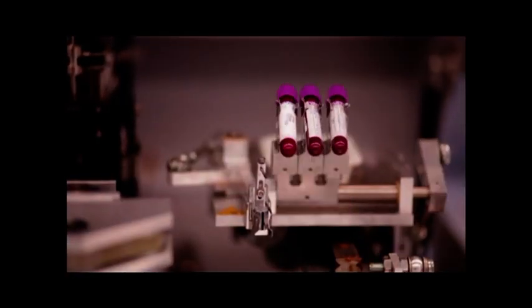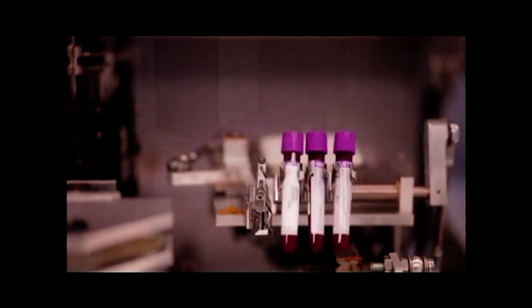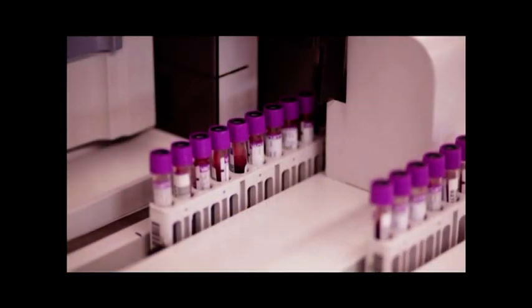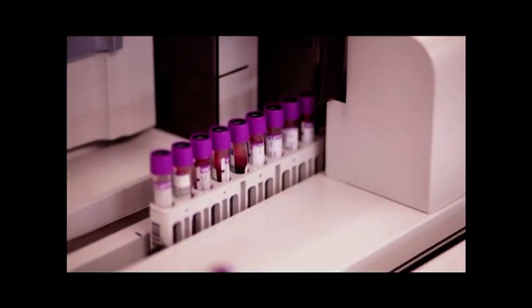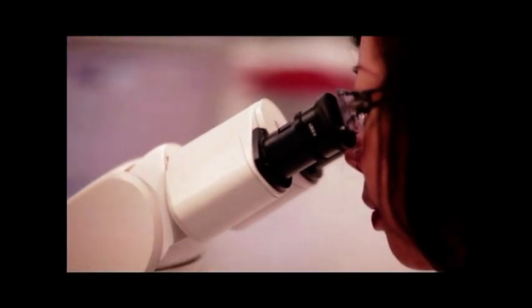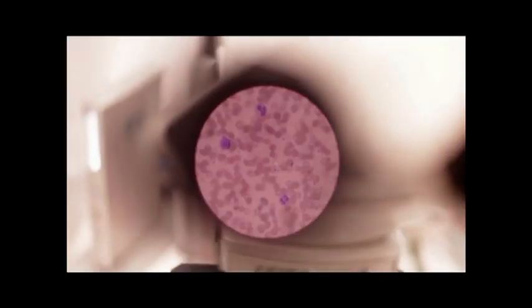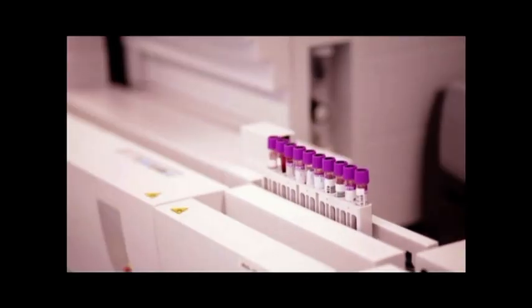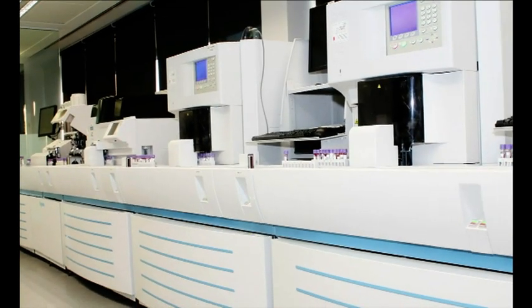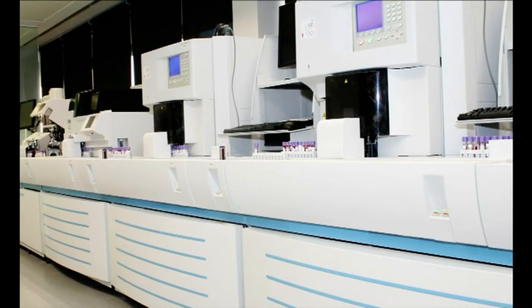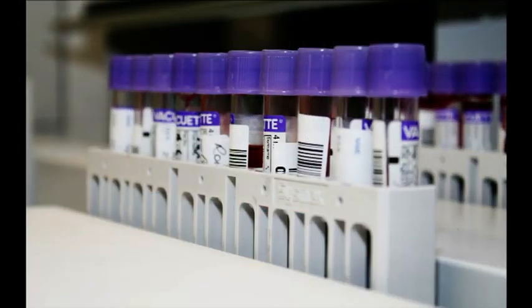The Sysmex CA1500, XE2100 and SP1000i are combined to provide the best efficiency for the Haematology department. The XE2100 uses a unique platelet technology that minimizes review rates and gives accurate results.